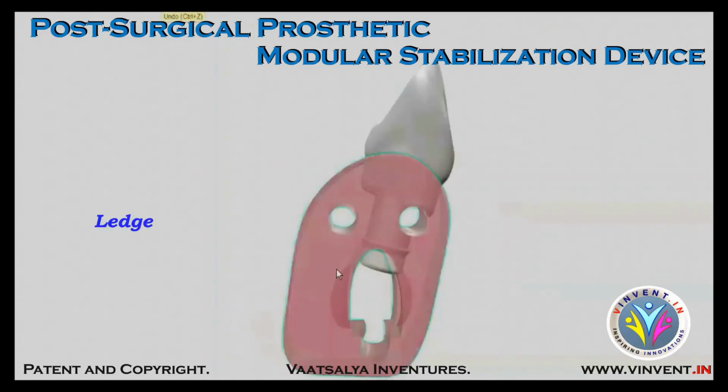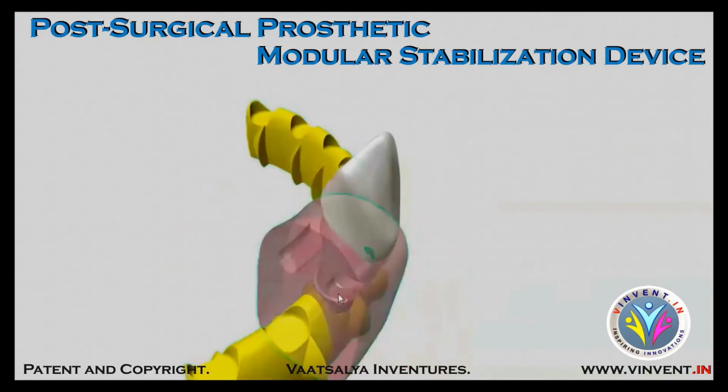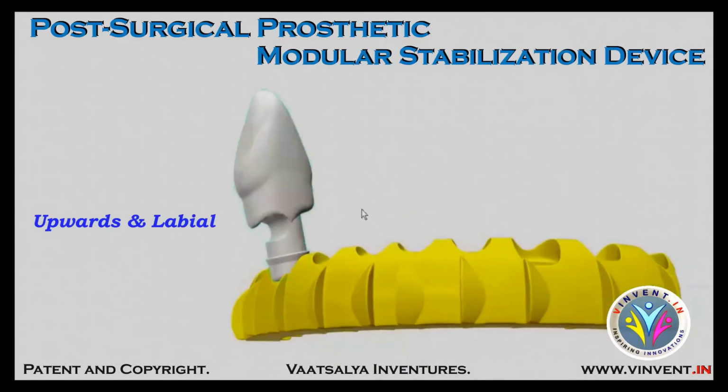The tooth component also has a ledge which seats in its respective slot within the soft tissue component for retention. This forms the relation between the three component types of our modular design for this device. Further, a retention feature for tooth component is also provided in the area of buccal retention wire, which when placed will engage with the tooth component to prevent its movement both in upwards and labial directions.